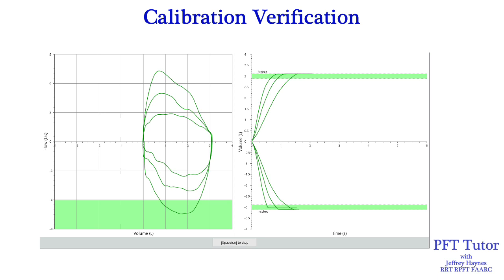This is an example of calibration verification — what you would be doing first thing in the morning when setting up your machines. As you can see on the right panel, these are the targets for both inspiratory and expiratory strokes at low, medium, and high speeds, and these strokes are outside of that range. In the left panel with the flow volume loop, each row that turns green indicates that the cal verification is within the target range. Only the inspiratory at high flow passed, so this failed calibration verification.